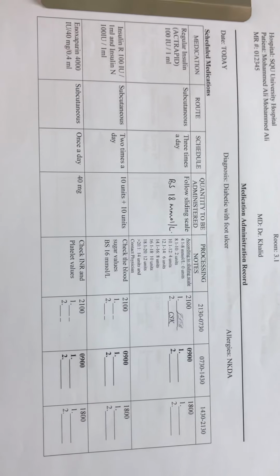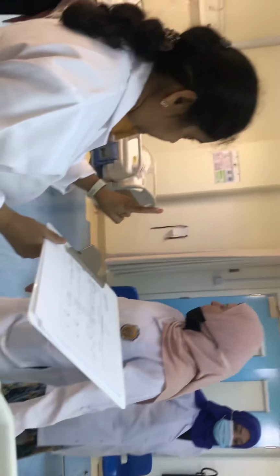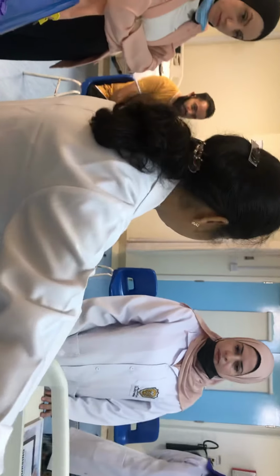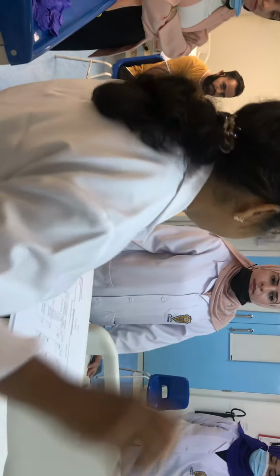Okay, when I go to my patient, imagine I'm not going through all the steps, if you are okay. Wash your hands, provide privacy, and then verifying the patient is very, very important. First identification. Always remember, for all the medications or injections, it is 2 identifications. So I'm identifying the patient. I'm asking him, where was your last one. So if he says other side or abdomen, wherever he says, I'm assessing that site, which is very important.